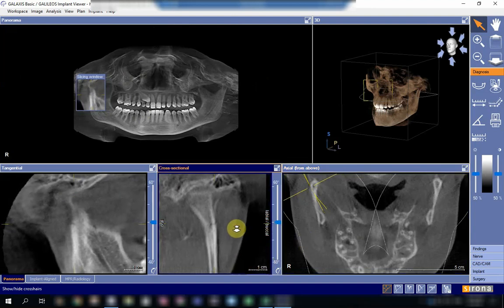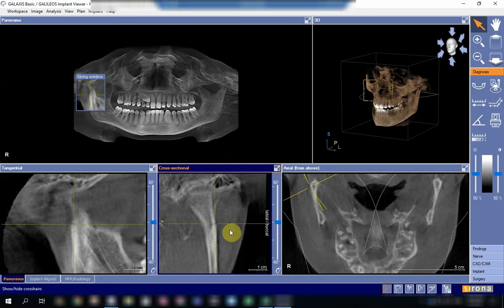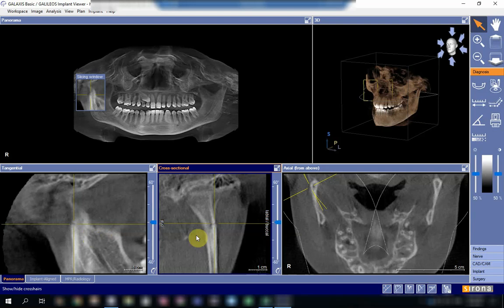Now the fracture is here. This is the coronal view of the fracture side, and this is the sagittal view.